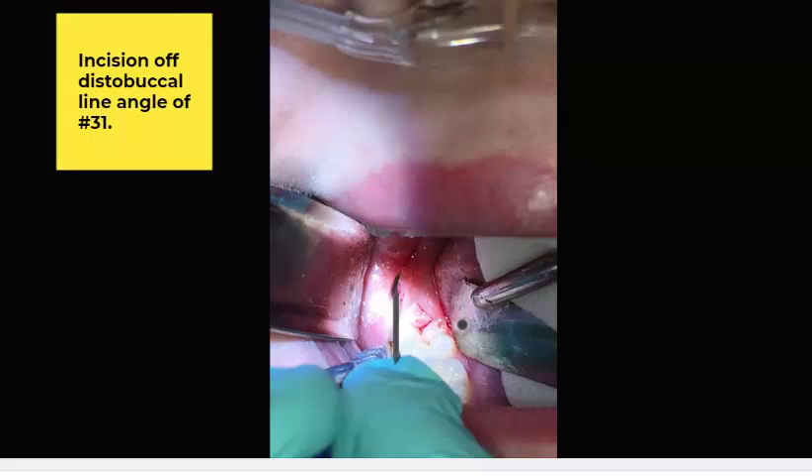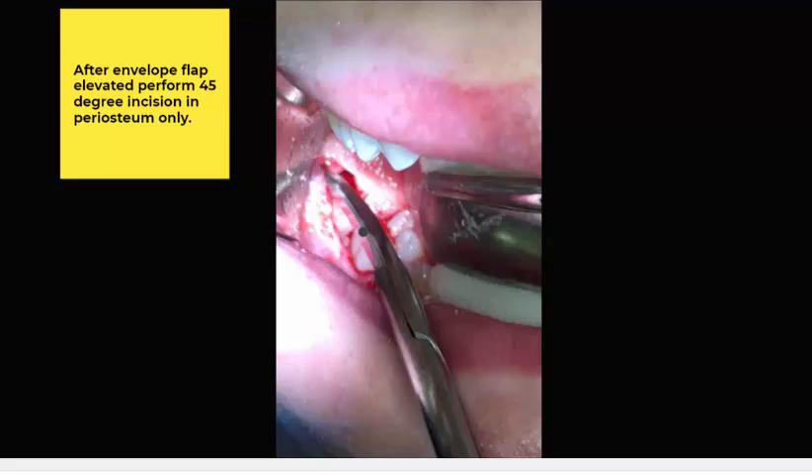I'll use a periosteal elevator — I use a 9-molt — and I'll lift up the flap and make a pocket or an envelope. Once that is created, here is my little tip or trick. Here is a Minnesota retractor, and I've got the soft tissue reflected — but I only have the superficial mucosa reflected. This right here is periosteum. I've lifted the flap up and pulled the mucosa back with my buccal retraction using the Minnesota, and I've exposed the periosteum. This is a little envelope, a little pocket that I've made here.